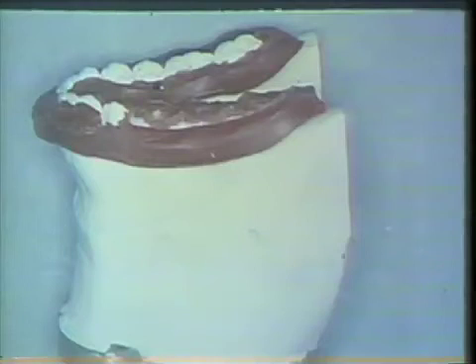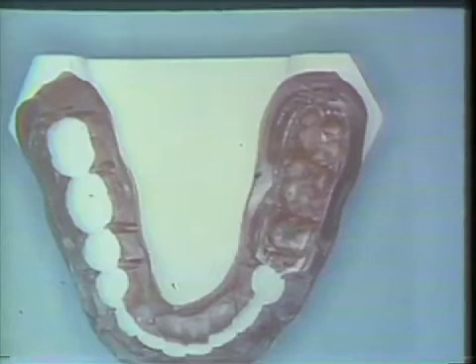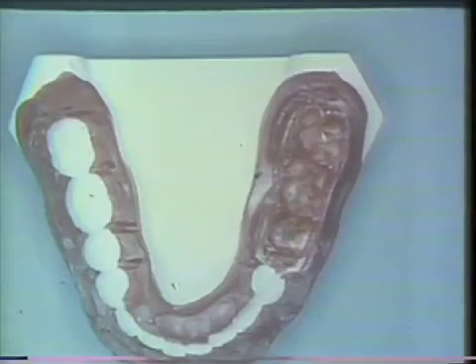Here you can see a side view with the square boxing wax in place and the occlusal surfaces of the teeth exposed. The boxing wax eliminates the stone from running down the buccal and lingual surfaces and locking itself in place. This slide illustrates an occlusal view. You can see the exposed occlusal surfaces and the functionally generated wax platform.